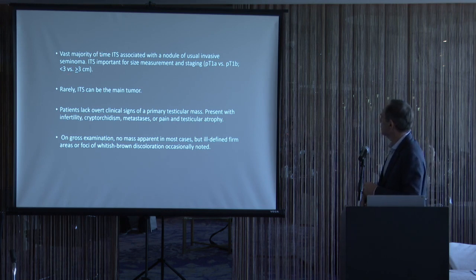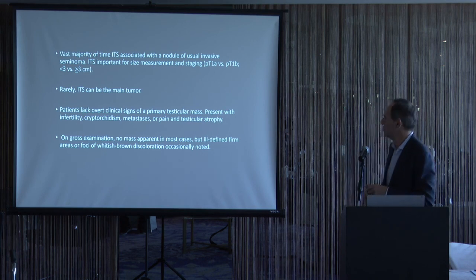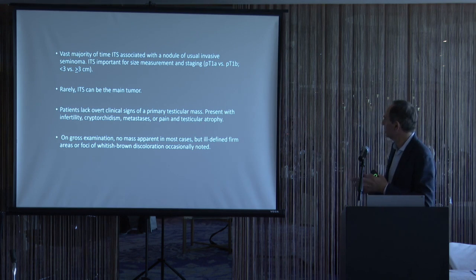So sometimes if you have intertubular seminoma, it's important to factor that component of the seminoma and recognize it for staging purposes. Most of the time when you see intertubular seminoma, it's accompanying invasive seminoma, but occasionally one can have only or predominant intertubular seminoma, and it can be difficult to recognize if you're not familiar with what it looks like.